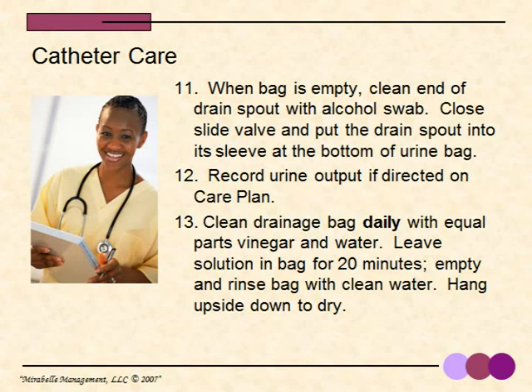Clean the drainage bag daily with equal parts of vinegar and water. You want to leave the solution in the bag for about 20 minutes and then empty and rinse the bag with clean water and hang the bag upside down to dry.